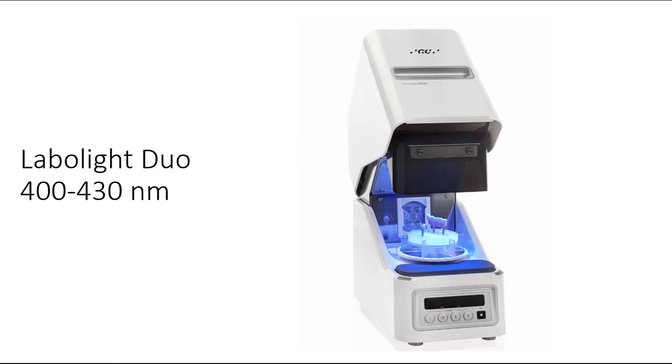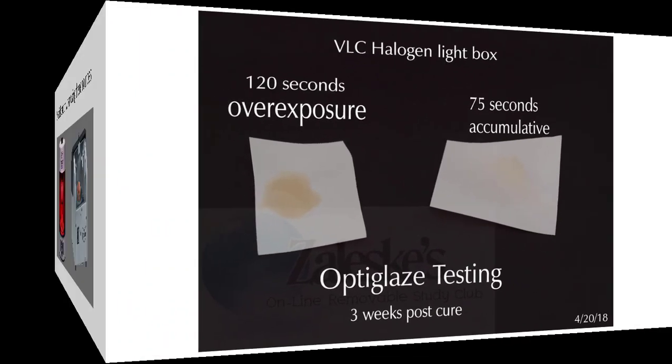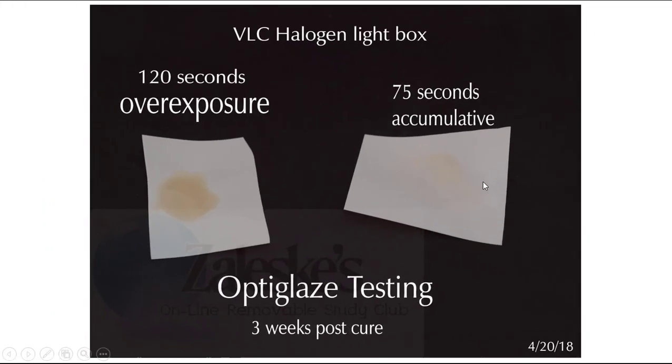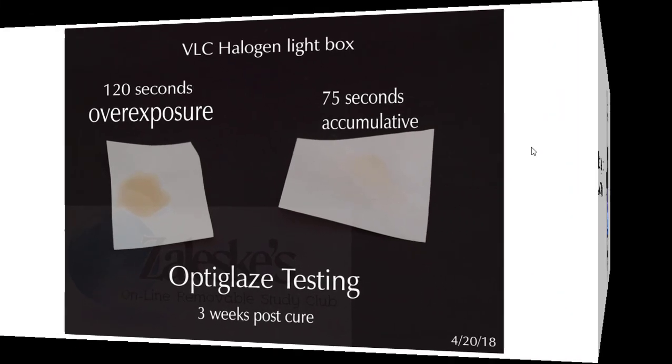However, like I say, you can use the halogen light sources, but you have to be very diligent about your exposure rates, okay? So again, just remember, if you're having these situations and you are using these units, this is your probable cause, okay? Again, there it is, a little brown, a little less brown. It's all about the exposure and the light source itself, the intensity.